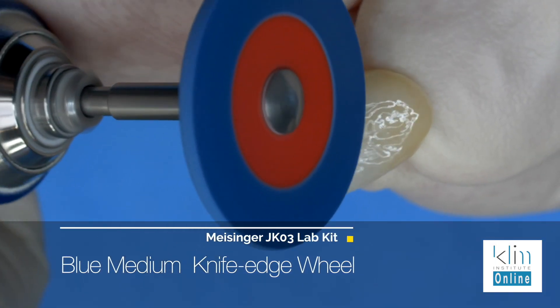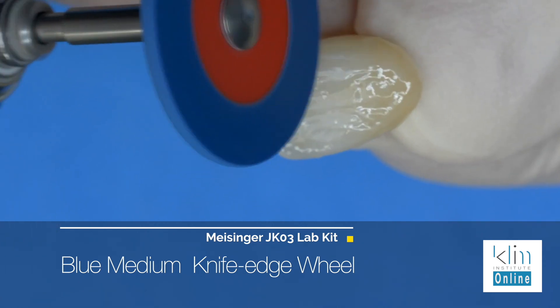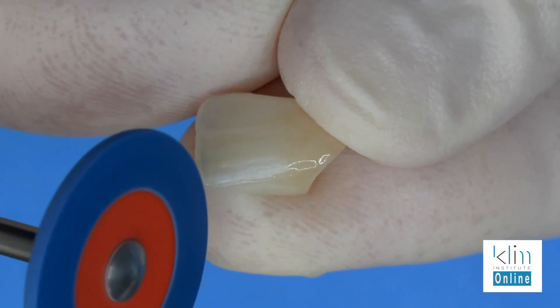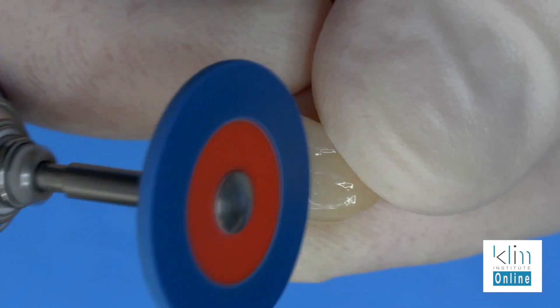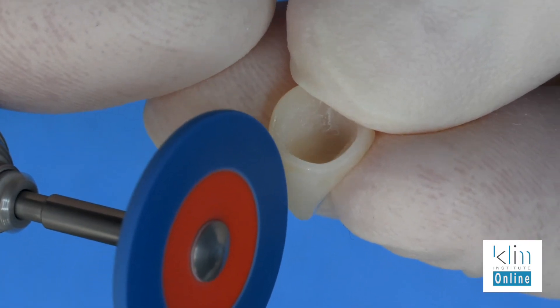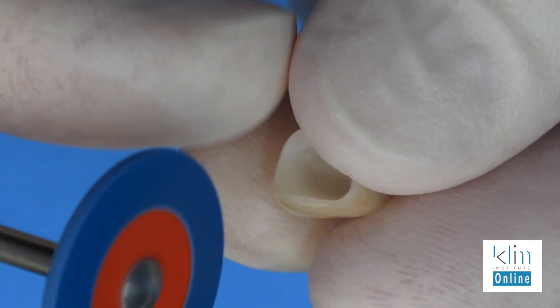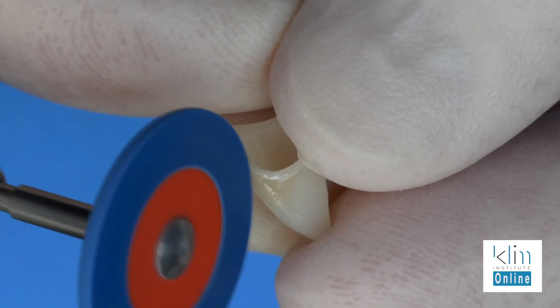Quite often, line angles are smoother. Any areas that are convex will see more wear. With the blue knife edge wheel, we'll polish those zones. You will find with the Mio finishing technique that there's plenty of thickness, so we're not concerned about wearing away color. The margins are polished as well. Any micro surface tags right at that margin, we want to make them very smooth. A light touch with the blue knife edge wheel will effectively smooth those areas.